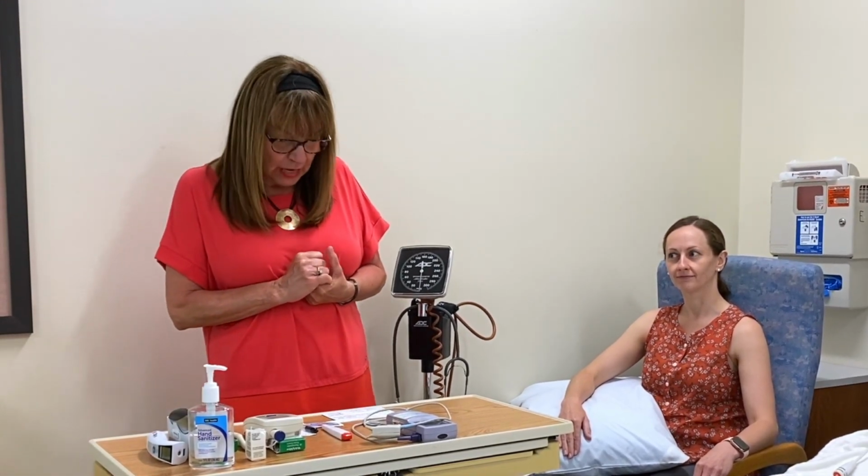Hi there. What we're going to be doing today in this particular video is demonstrating how to take vital signs appropriately per KVCC nursing program, and also how to measure SpO2. And after that, what we're going to be doing is the priority shift assessments, the foundation that you're going to be learning in the first semester, to be able to utilize in the clinical environment.